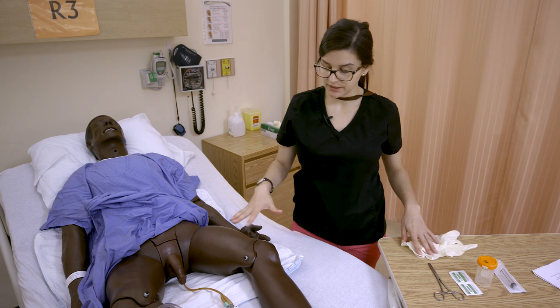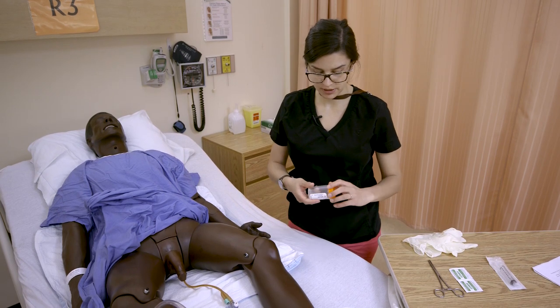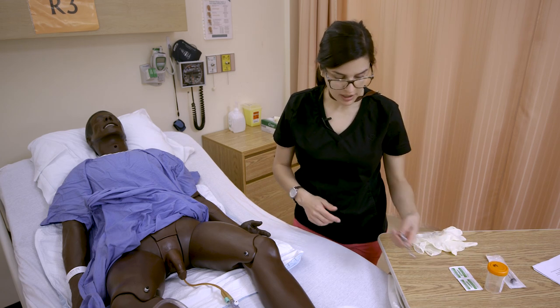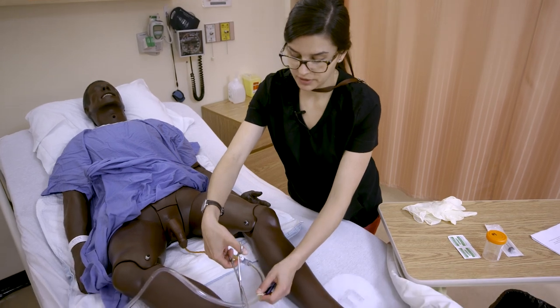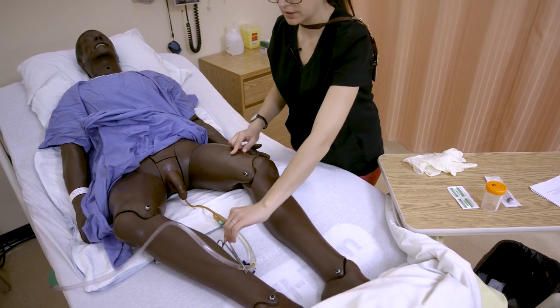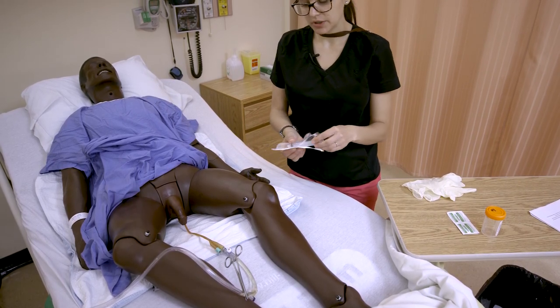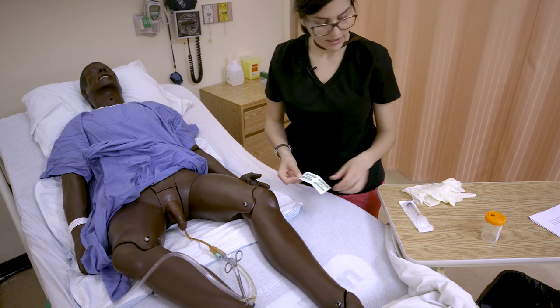The supplies you want for collecting this sterile specimen from a catheter: you're going to want a sterile specimen urine container — the orange top tube — that hasn't been used so the sterile seal hasn't been broken. You're also going to want forceps, which look like scissors but have a flat edge, because we're going to kink off the tubing a couple centimeters down from the port so urine can collect there. You'll also want a new sterile Luer-lock syringe — we grabbed a 10 cc because we only need about three to five mls — plus alcohol swabs and gloves.